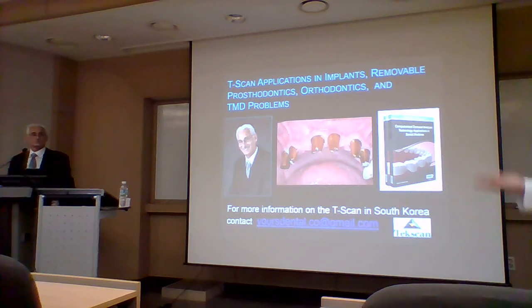Every patient, every patient have a chance to experience with teeth scan? Well, I think you were asking if they were asymptomatic and they needed crown and bridge work that we were going to make. Yes, you can take preoperative T scans and try to replicate that. It's easier said than done, to be honest with you. So more practical is you take the T scan data as a guideline, and then when you deliver the case, you can try to create the same profile, but it's not always exactly the same.